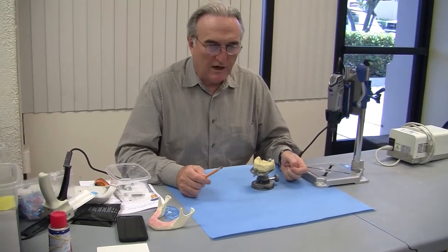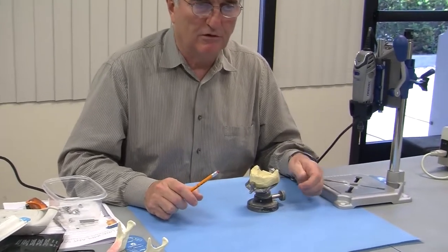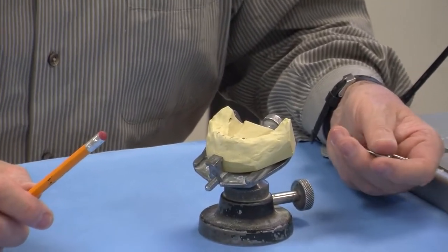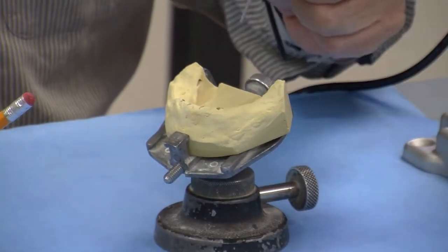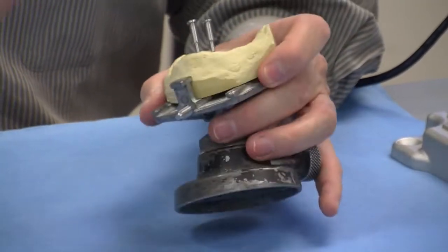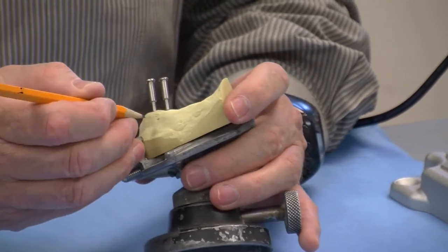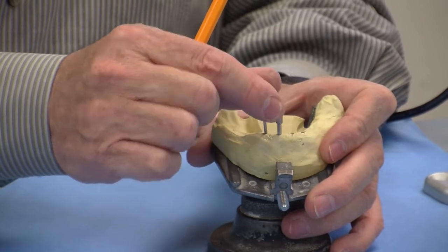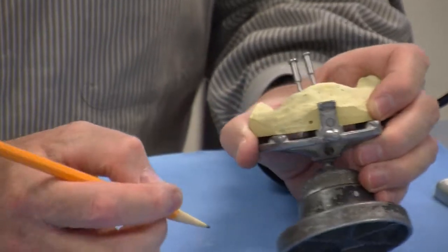Very often when we have an edentulous jaw, it's hard to always keep the surgical guide in the same position. So in order to do that, Cyber Implant offers a very minimally invasive fixation system. We're going to put 2 pins to visualize the direction of the implant, and then we're going to locate the entry point of this fixation screw. Then we will repeat the same thing on the right side of the patient and locate the fixation screw entry point.